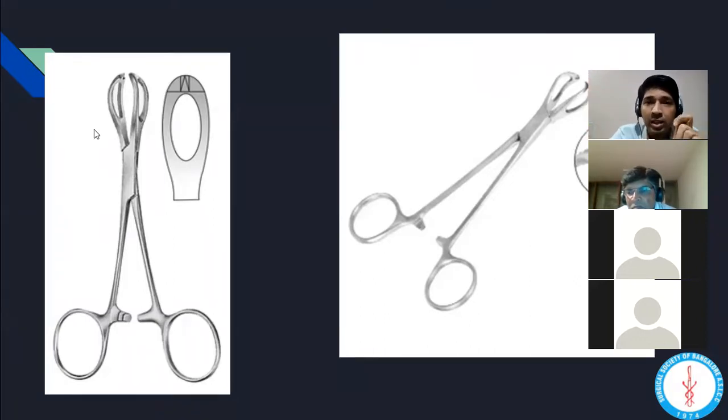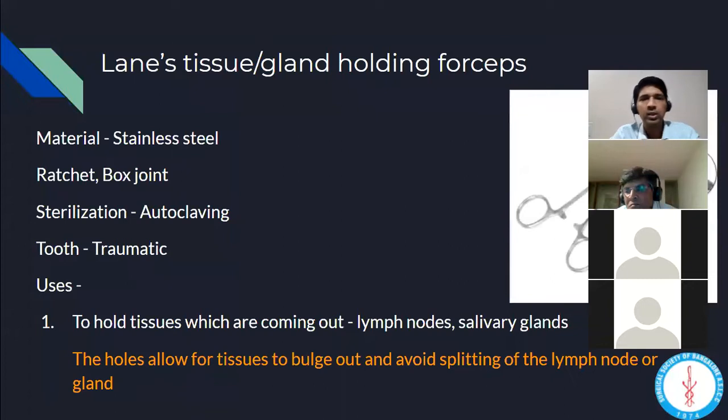It's very important when you're excising lymph nodes that you excise it in toto and you don't crush the lymph node, because we all know that when we send crushed lymph nodes, the pathologist always says you won't get the diagnosis you're expecting. So you always need to send the lymph node in total, and you don't want the capsule to be ruptured.